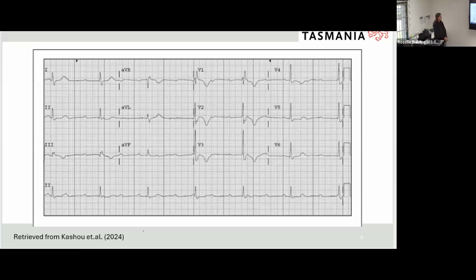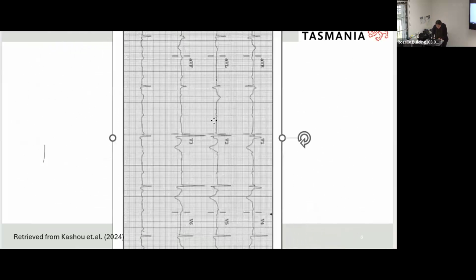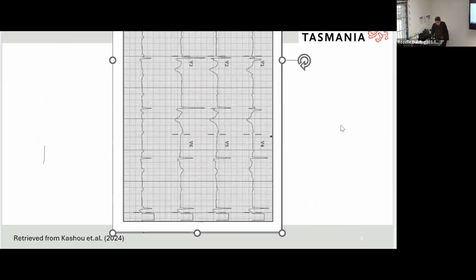So Nathan's raised a good point there about how we rotate ECGs as well. That's another trick we can use, especially because we obviously have a printout. If we point the ECG up, then the direction your leads are pointing can tell you whether you're suspicious of a right or a left bundle branch block.